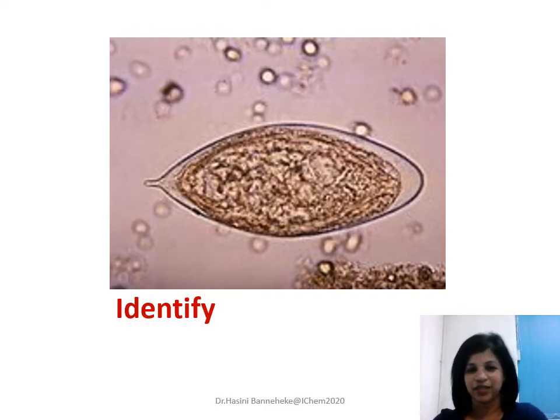So now let's see another structure. Now this is of course not from a stool sample. This is from a urine sample. See whether you can recognize them. Now these are not present in Sri Lanka. In fact, if at all we see patients returning from the Middle East or maybe from the African side, these cases may be reported, but otherwise this disease is not prevalent in Sri Lanka.